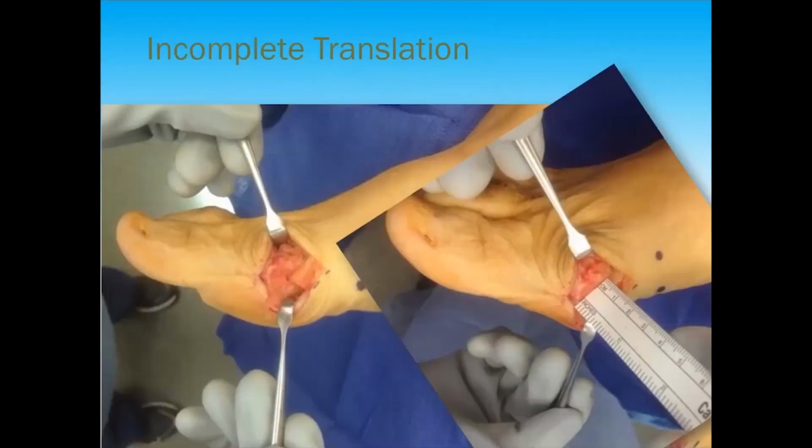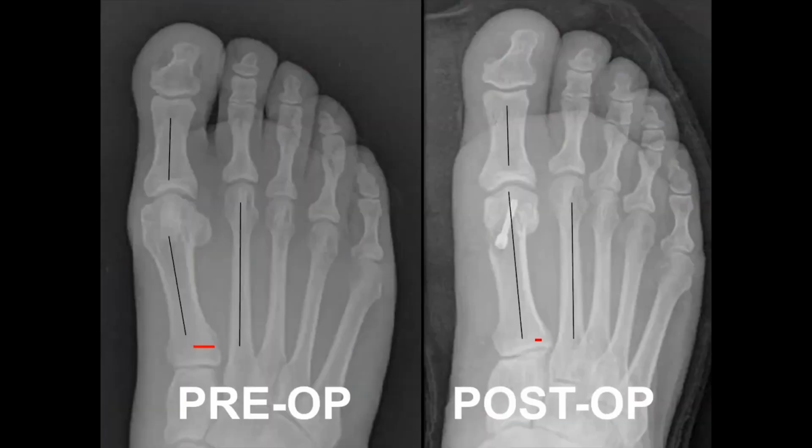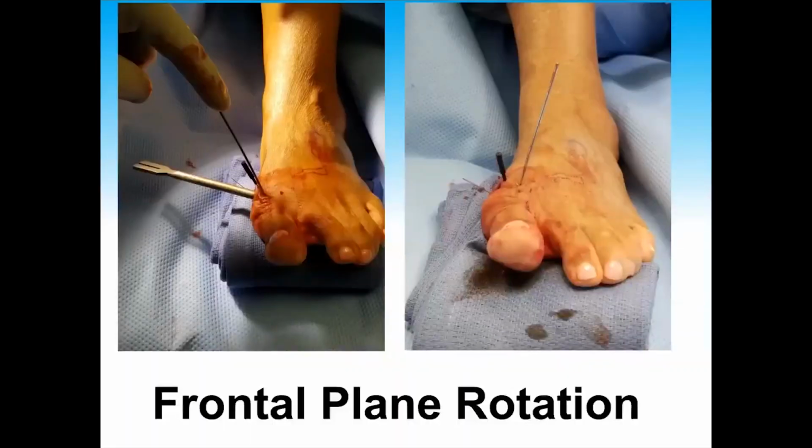So we did a study where we took a bunch of patients and measured intraoperatively how much translation I performed, and my fellow measured how much preoperative translation would be required based on that description I just mentioned. This study did show that we could accurately realign the sesamoids by lateralizing the capital fragment the necessary amount. So translation is important, and it can be preoperatively predicted, and shouldn't we be more accurate than just shifting it till it looks good? That's the concept there.